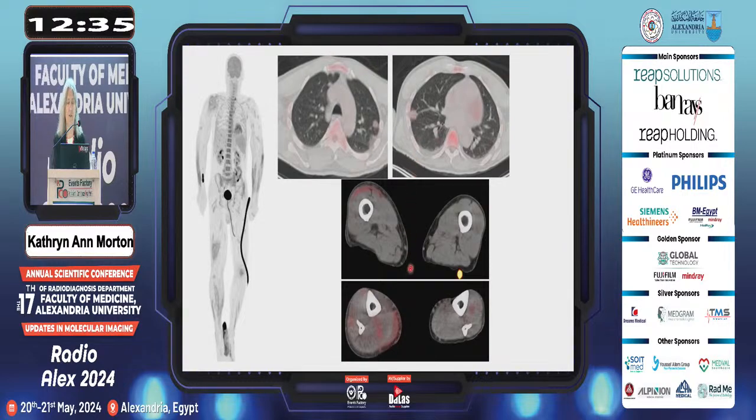There were multiple hypermetabolic lesions within the lungs, most of them peripheral, consistent with septic emboli. But in addition to that, you see subfascial areas of increased metabolic activity within multiple sites. So, necrotizing fasciitis with staph. Staph is a facultative anaerobe, and it can grow without being anaerobic and may not be gas producing.